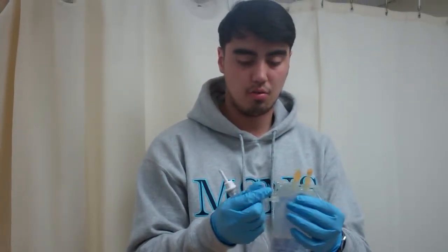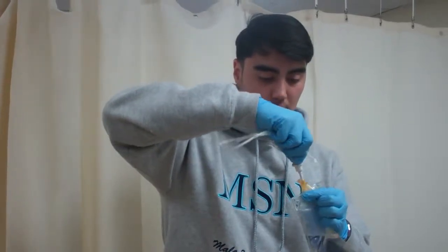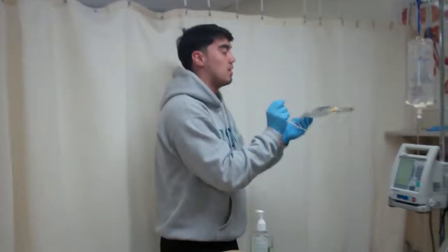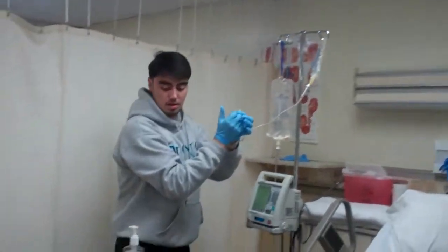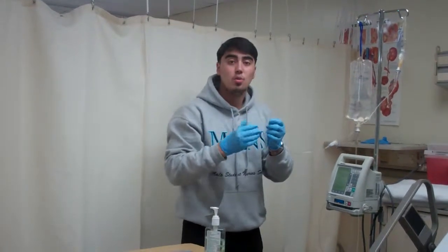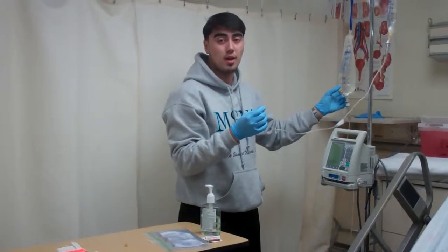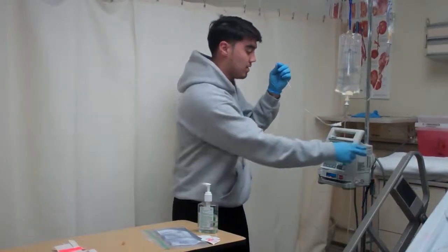Then you want to ensure that when you spike it, you're maintaining medical asepsis. Go ahead. There you go. We have that on. Then we're going to go ahead and hang this on to the pole. So the next thing we want to do is attach it to our primary line. And before we attach it, we also want to ensure that the medication is compatible with the primary line, with the primary fluids that are running, okay? So I've done that and they are compatible, so I'm able to go ahead and connect these two.